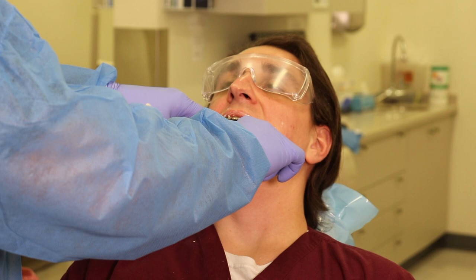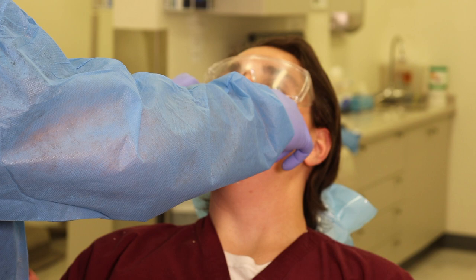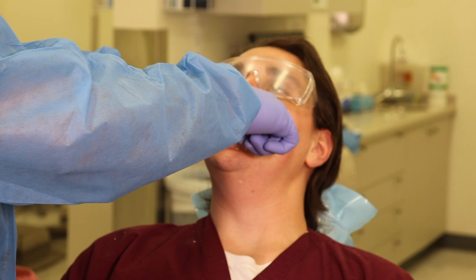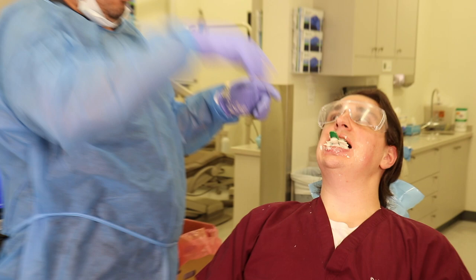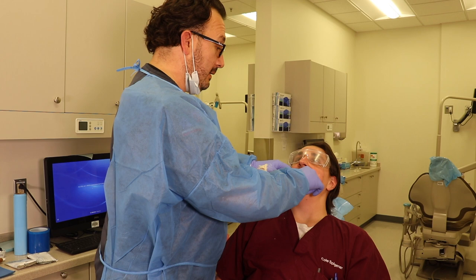But inside of the mouth, because of the temperature inside of the mouth, it'll set faster than outside. I always need to be very, very careful on keeping it stable. Many people just take the impression and they take off. You cannot take off. You have to be very careful of the excess going to the back of the mouth. You have to be looking at your patient's reactions, and you have to be very careful on taking these impressions, or you don't take it. You have to take it very serious.